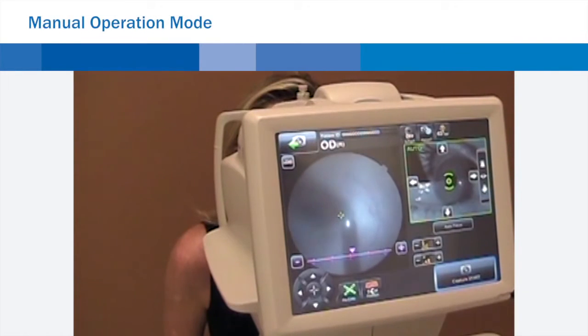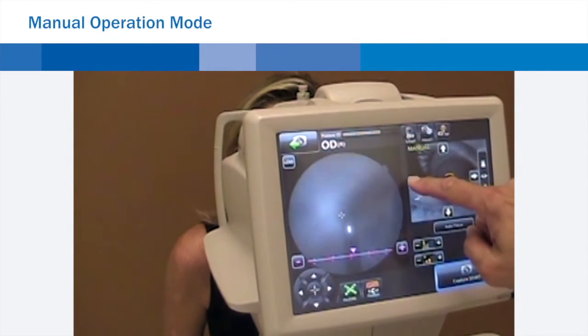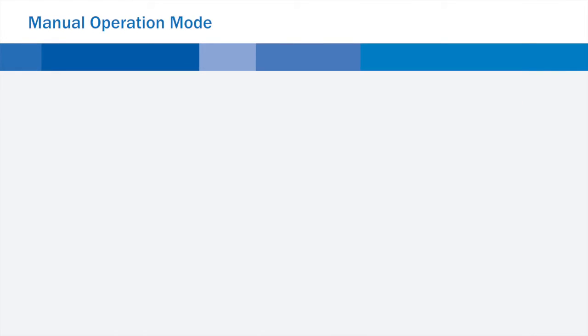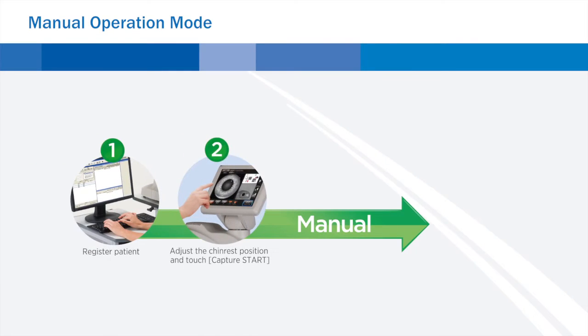In manual operation mode, the operator can drive the camera using the touch screen as if via the control lever. This is particularly useful in cases where auto mode is not possible, or a specific area of the fundus requires illustration.